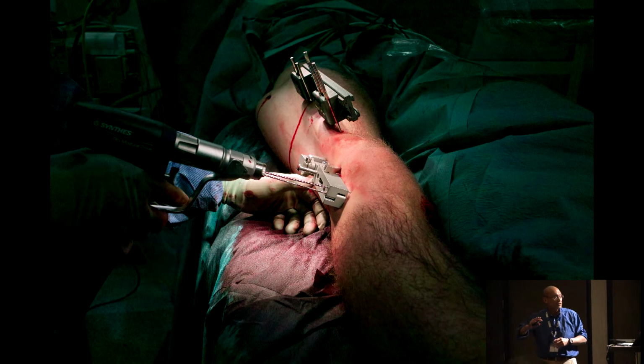I derotate first, solve that rotational abnormality, and now I put a second rail in the coronal plane away from the trajectory of a nail. And I can now focus on the coronal plane or even oblique plane deformity like I did before.